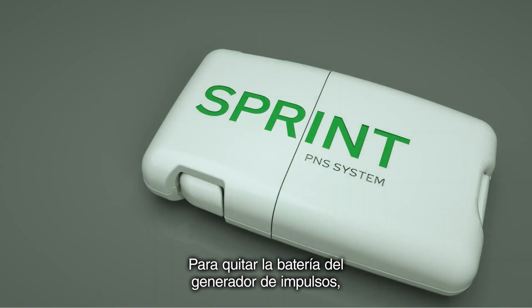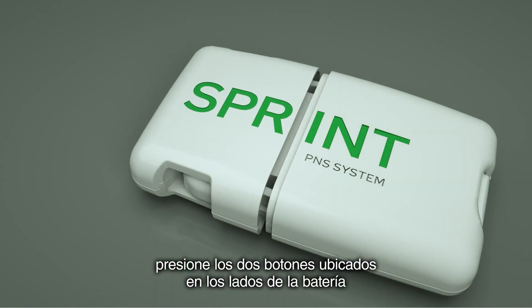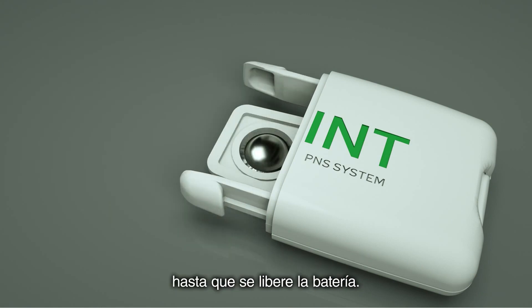To remove the battery from the pulse generator, press the two buttons located on the sides of the battery until the battery releases.